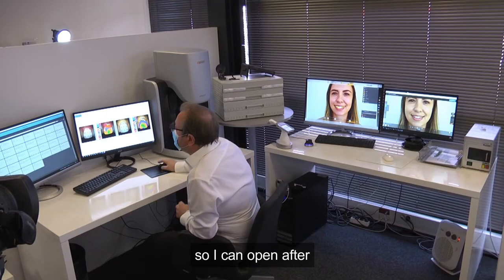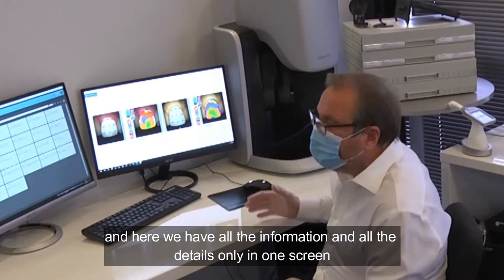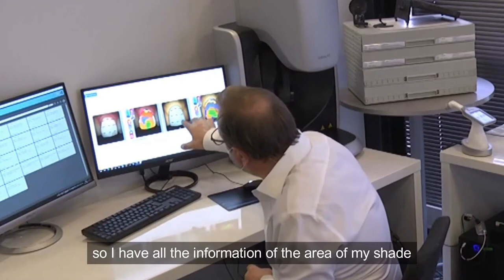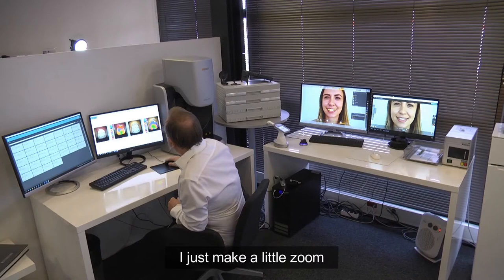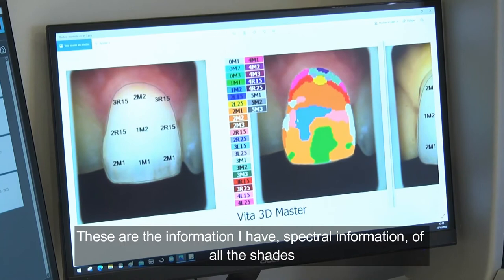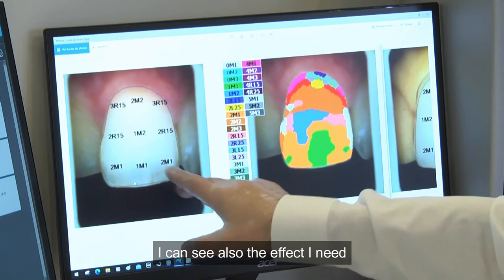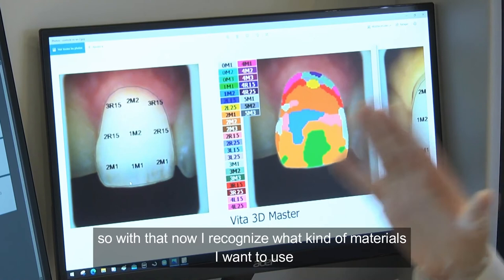I can open it and here we have all the information and all the detail in one screen. I have all the information of the area of my shade, and we can adjust it a little. I have spectral information of all the shade, and with my polarized filter I can also see the effect I need.